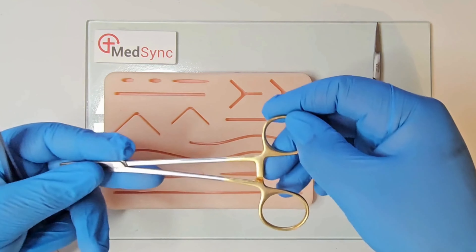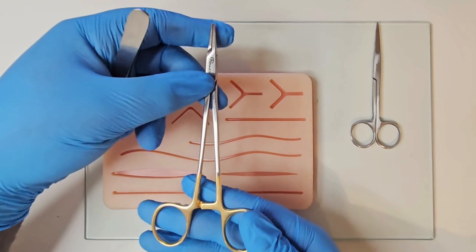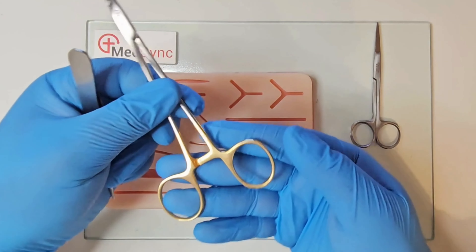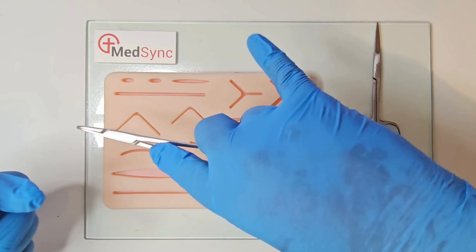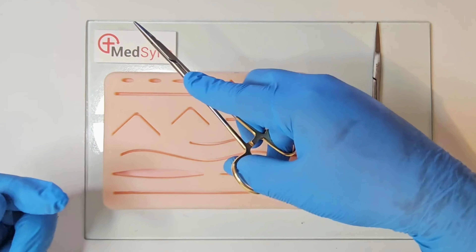The needle holder has jaws; the arms are called shanks, a ratchet, and rings for fingers. You place your ring finger and thumb in the rings, middle finger at the base of the shank, and index finger along the shank. You can use your little finger as a pivot point for extra stability.